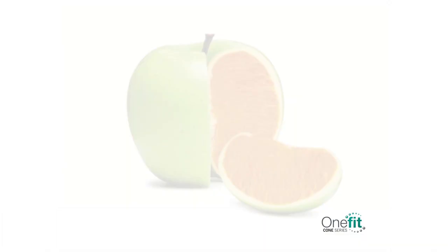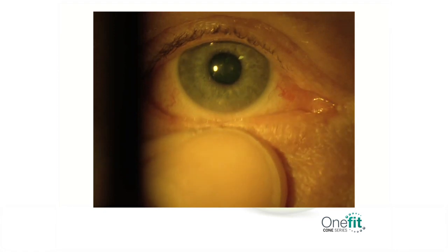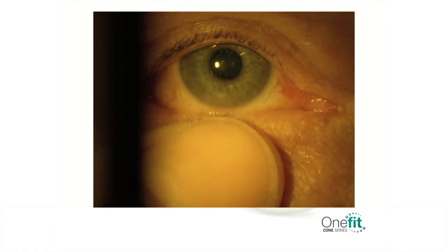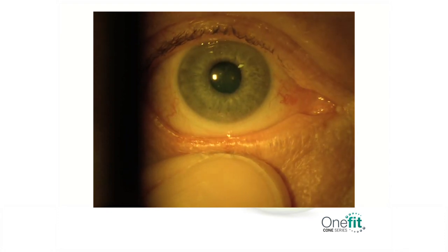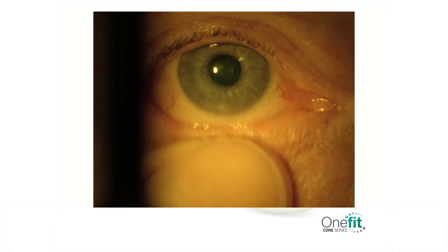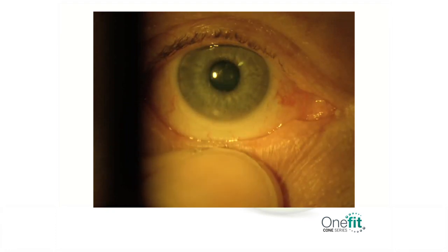It is important to evaluate the lens-conjunctiva relationship by performing a push-in test. Do so by applying gentle pressure on the lower conjunctiva. This is the in movement. And then, while applying this pressure, push the lens up. The lens should offer little to no resistance and exhibit 0.5 to 1 mm of movement, not with blink, but under the push-up pressure. If the lens moves too much, this could be the result of either an excessively flat edge or the lens is too steep without indenting the conjunctiva.